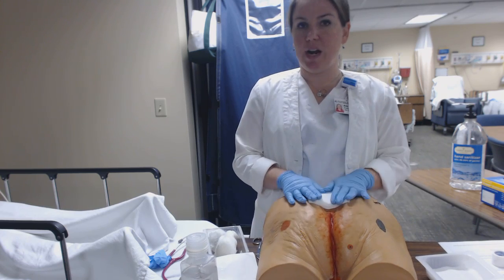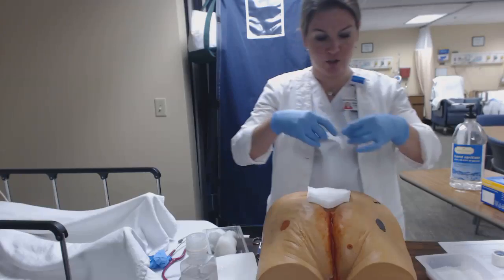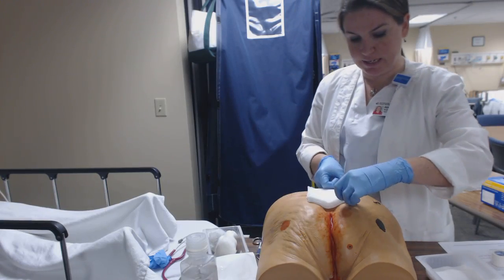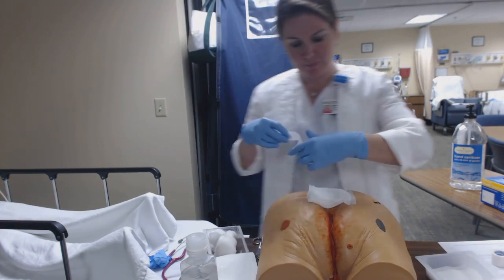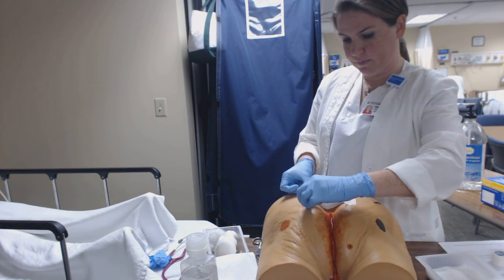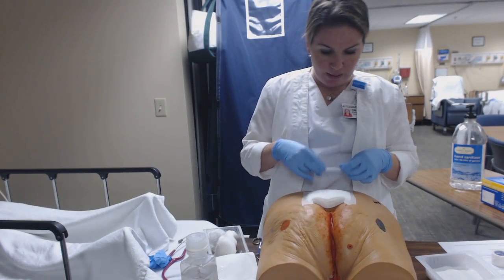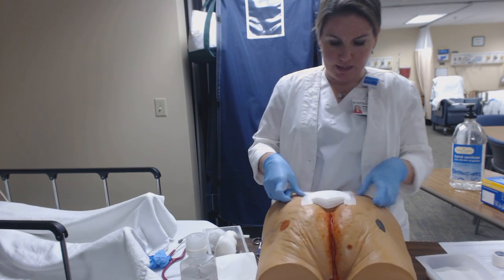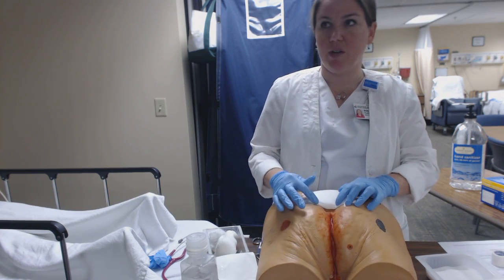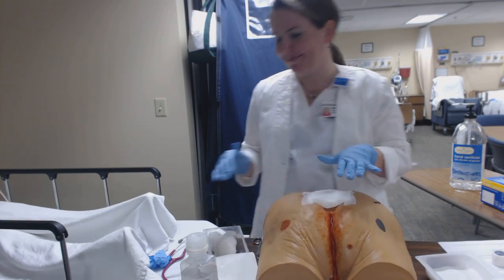All right, so now we have that, and we can tape our dressing. And look, I don't have to struggle with the tape pieces because I already have them ready for me. And this is a tricky area to tape because, as you can see, it's going to be falling right into the crack here.